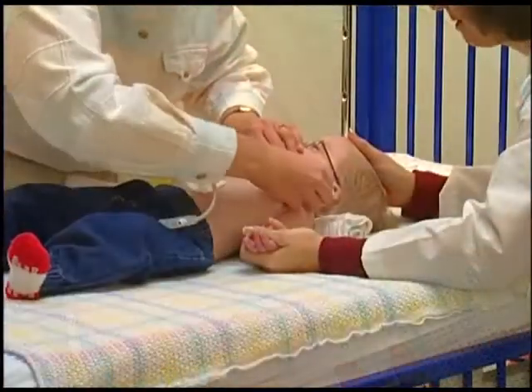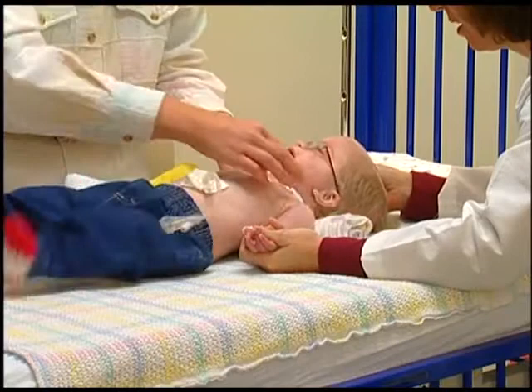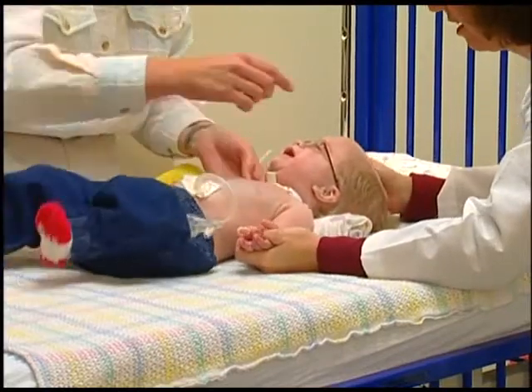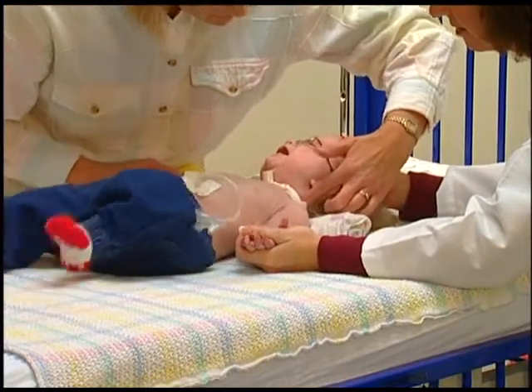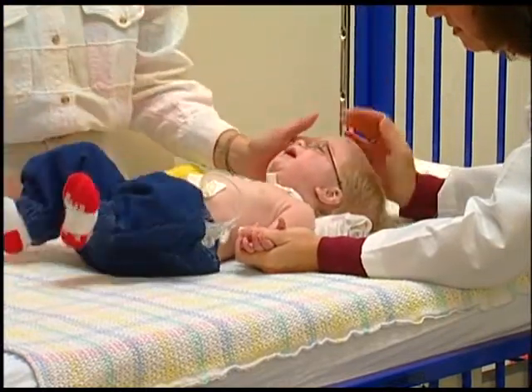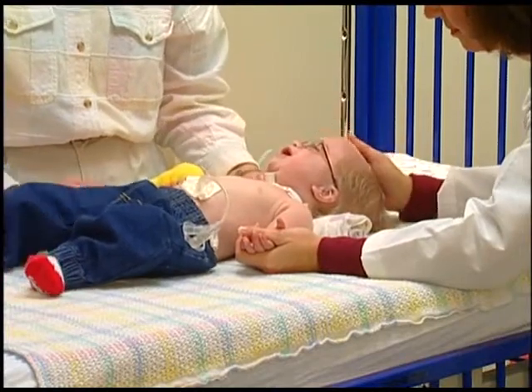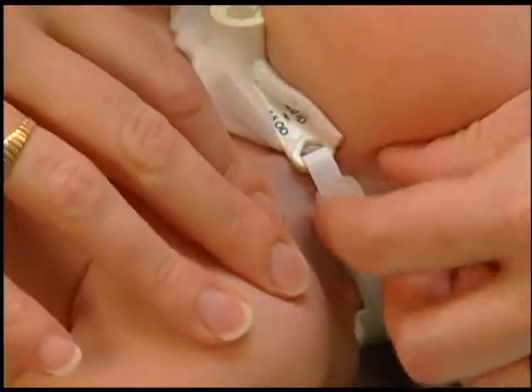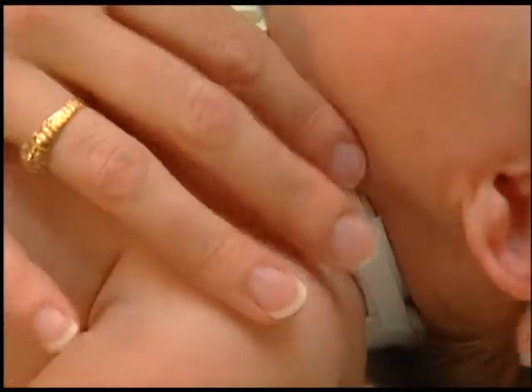If using twill string ties, your nurse will be able to demonstrate the technique for replacing these ties. Instructions for changing trach ties can also be found in the Shiley Pediatric Tracheostomy Home Care booklet. Always check the fit of the trach tie. The ties should be tight enough that only the tip of your finger can fit between the tie and your child's neck.